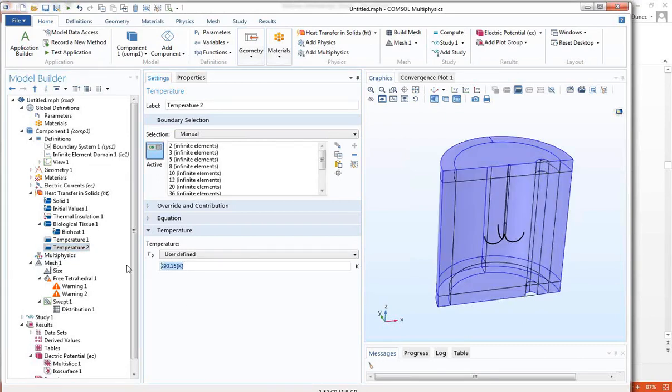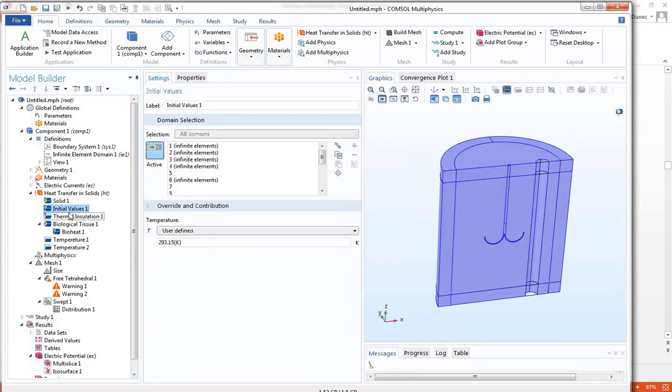I'll go back down here. I'll go to T blood. T underscore blood. Okay. And that's good. I also want to start with an initial temperature of T blood. Now, some people say, well, wait a minute, the catheter was at room temperature, wasn't it blood temperature? Can you handle that? Sure. I could always do T underscore blood here.